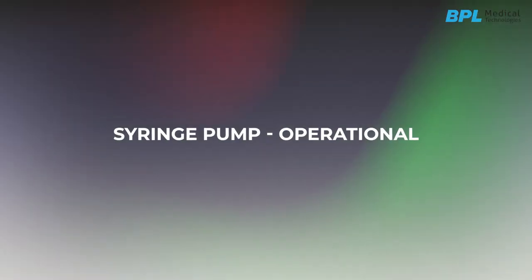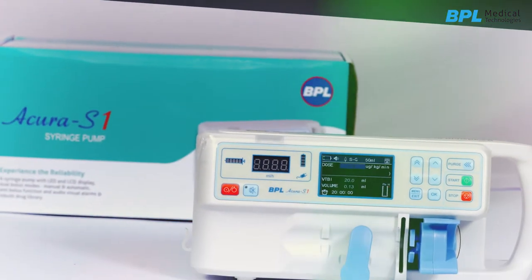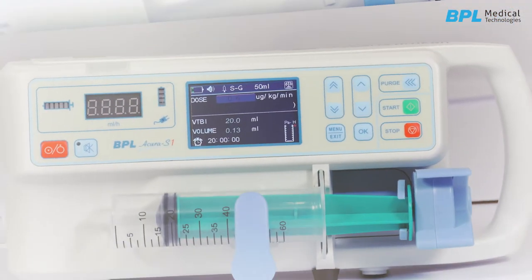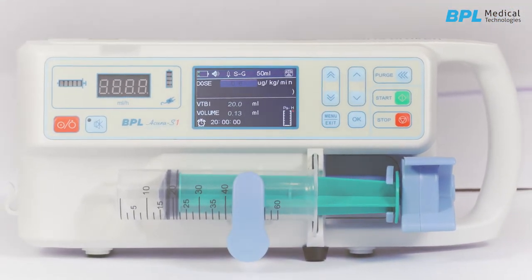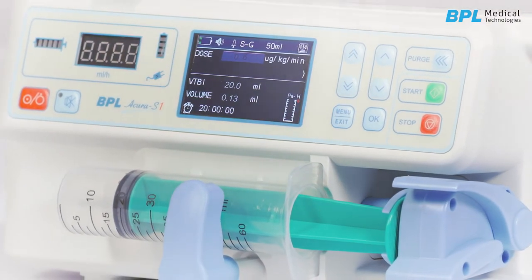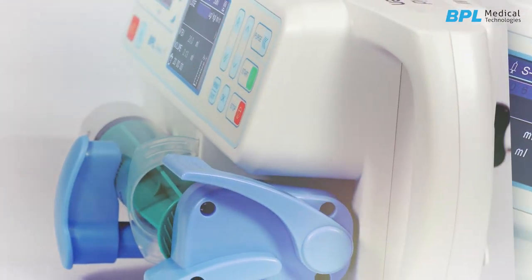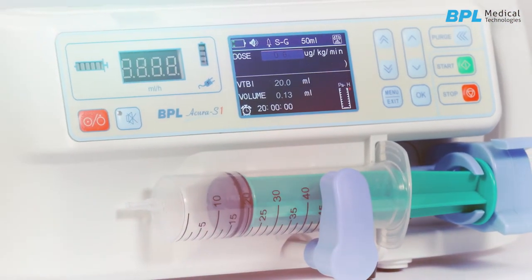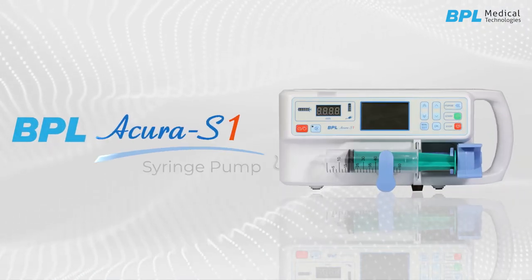In this video we will see the operational part of the BPL syringe pump Acura S1. Syringe pumps have been widely used in hospitals to deliver a very small amount of medications into a patient's body in a controlled manner, by mechanically moving the piston of the syringe to infuse medication into IV tubing.